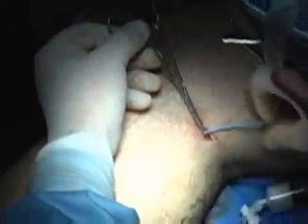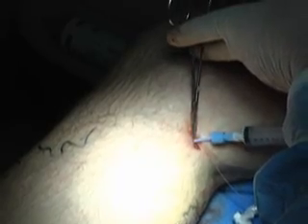This is comparable to lasers. We have tried lasers in the past for this same thing. The laser is a lot quicker and easier on me but we found that it's a lot harder on the patients. This tip cooks up to 2,000 degrees, boils the blood, and the boiling blood then damages the vein. Our patients were having bruising and swelling on their legs for up to two weeks post-op. But with this procedure — the venous closure procedure — patients often have no bruising whatsoever in the legs.